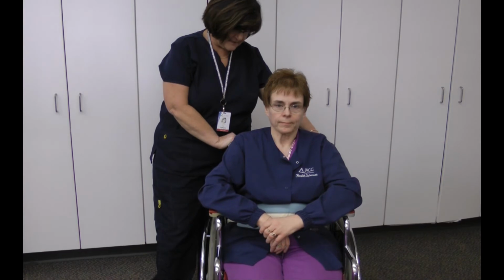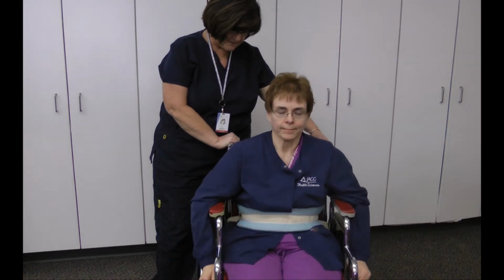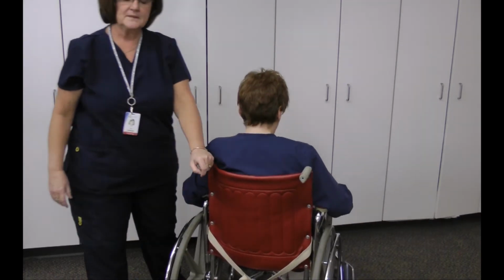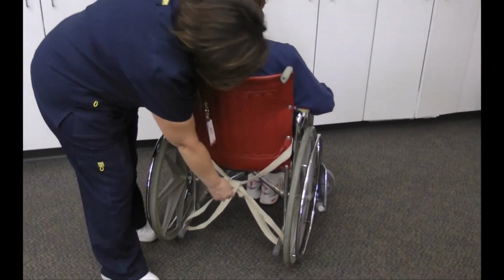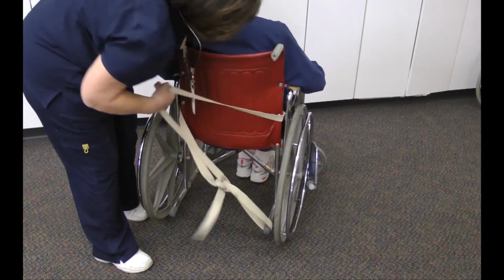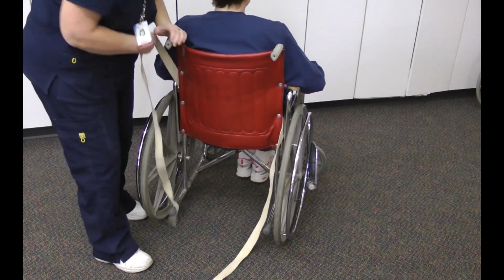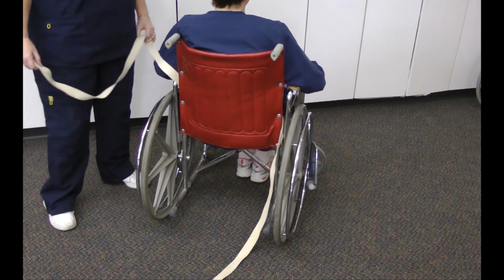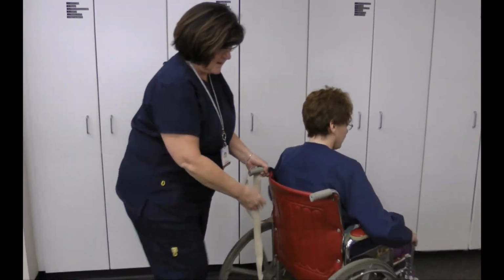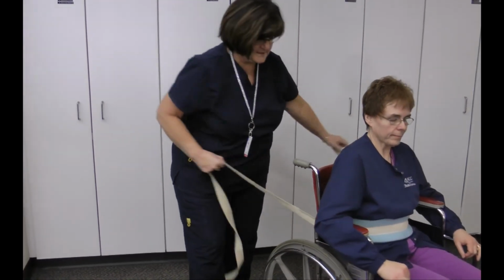Again, go ahead and unlock it, and I'm going to show them how to take it off really easy. So let's say we had to remove Melissa in a hurry. We just bend over, we pull this, and it comes right off with one pull. That's what's important with the restraint, okay? I'm going to go ahead and take this off.